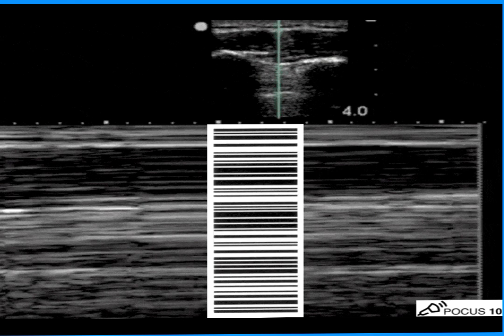However, there are cases where the quality of the image is not as good, or you are not sure. You think, I think I see motion, but I am not sure. What do you do? This is where we use M mode again. So we hit the button, and we generate that nice vertical M mode line.